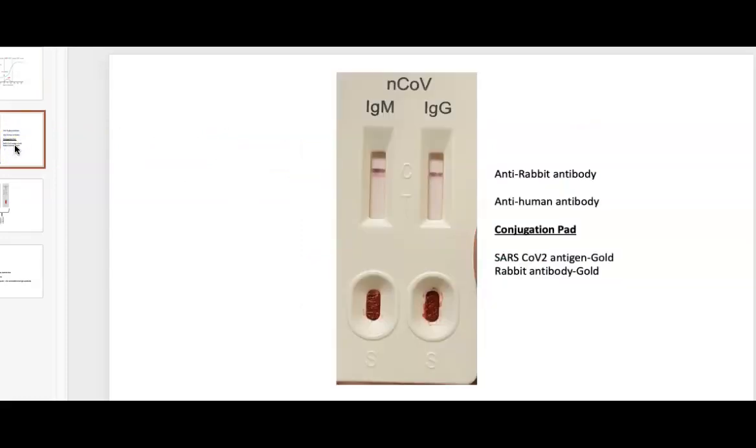So the way this lateral flow assay works is through this mechanism that's illustrated here. The first thing that we do is we apply blood to these sample wells, and this can come from a lancet or a finger prick of some kind. In this particular case, the blood is applied, and then a drop of buffer is applied, and that pushes the blood and buffer combination over a conjugation pad.